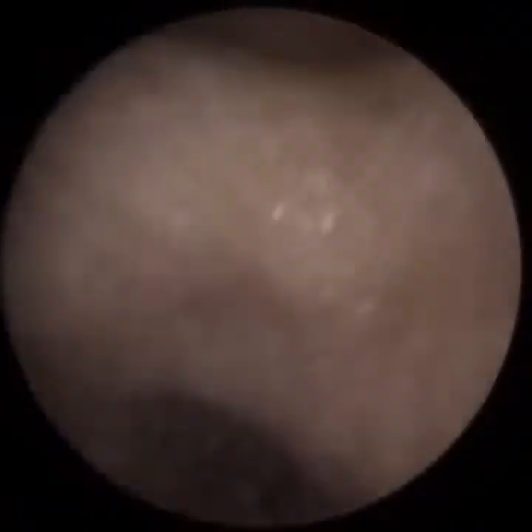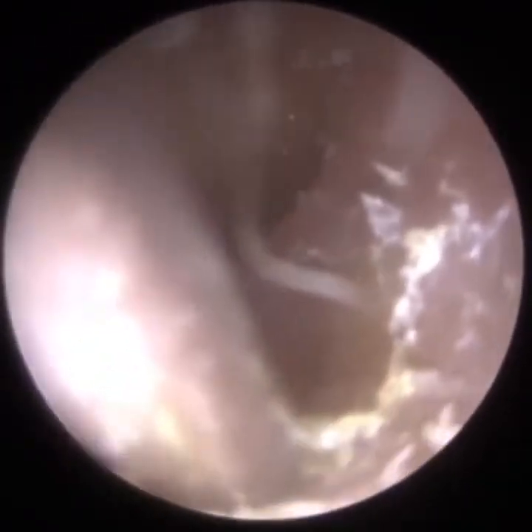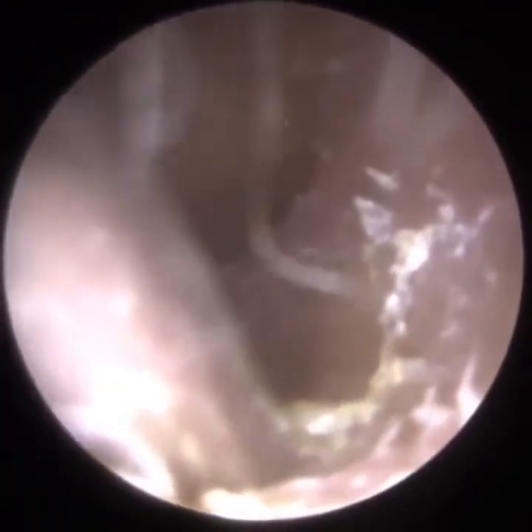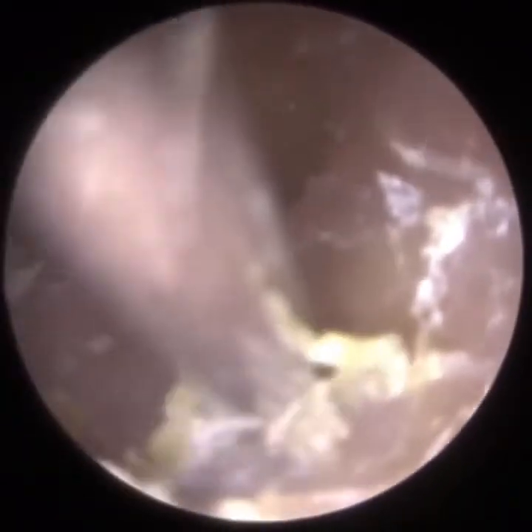And when we're on the outer part of the ear canal, the cartilaginous part, the skin is a lot thicker, so we can put a bit more pressure on there. It's less sensitive for the patient when we do. You can just see the ear canal, how it goes upwards, the inclination. It goes up, then it goes down, almost like a ski slope. It goes up and then suddenly down. Just some more skin that we're peeling gently.